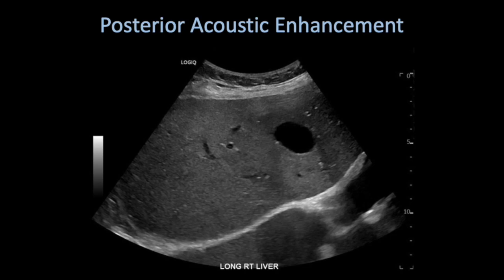Let's look at this example of posterior acoustic enhancement. In this ultrasound image you can see a cyst within the liver. Posterior to the cyst, you can see that the liver parenchyma appears brighter than the background liver parenchyma — so-called posterior acoustic enhancement.